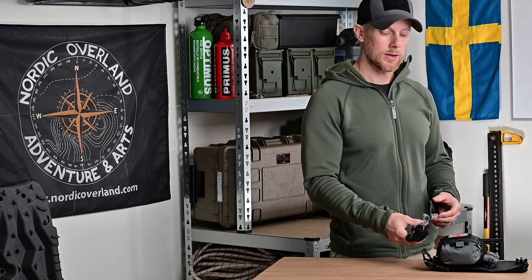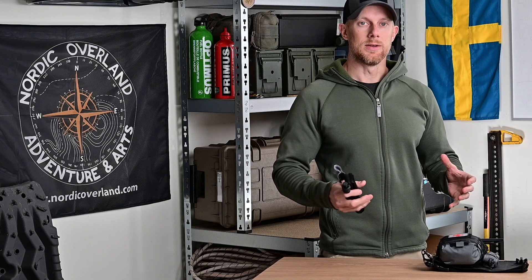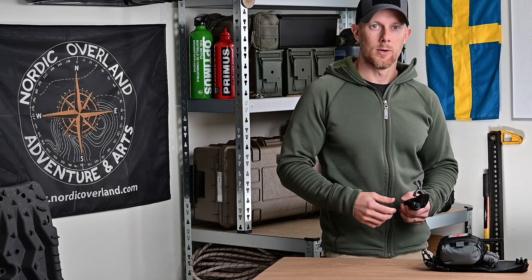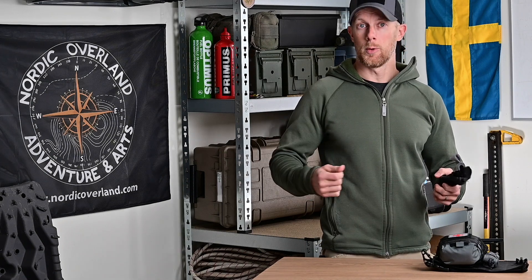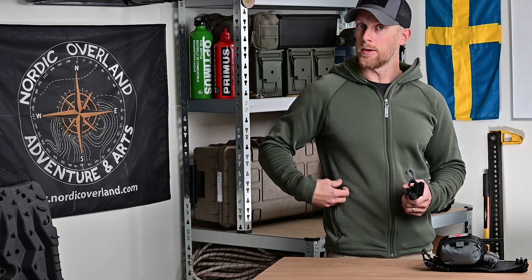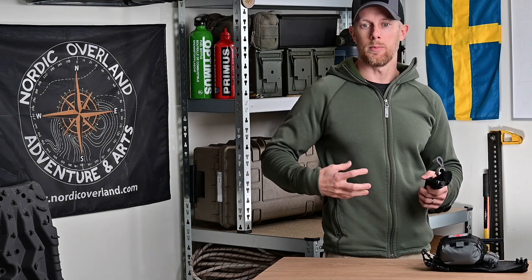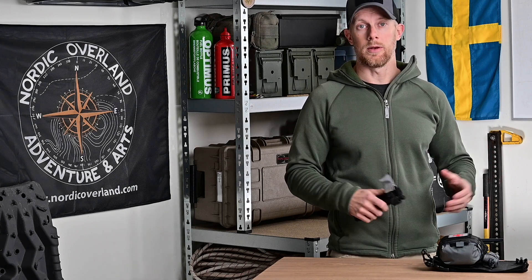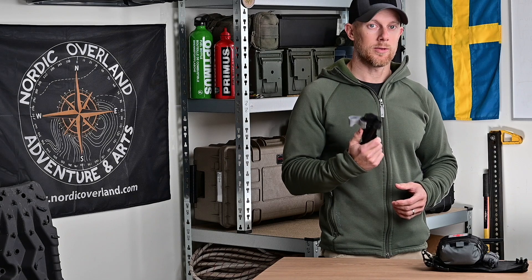Jag rekommenderar inte att ha en toniké fastsatt på utsidan över tid när du kör, där den blir utsatt för vädrets makter. I en ficka är det bättre. Det är också värt att se till så att du kan öppna fickan med handsken på. Om du har en dragkedjeficka utan ordentlig flärp, fäst gärna ett litet snöre eller en tamp som ger bättre grepp. Benfickor har ofta ett större lock som är enklare att hantera med handskar.